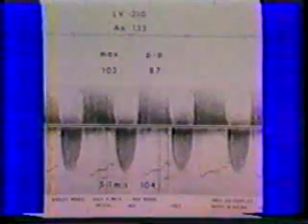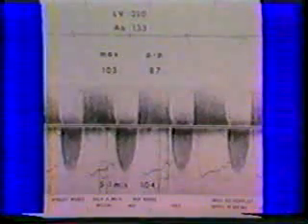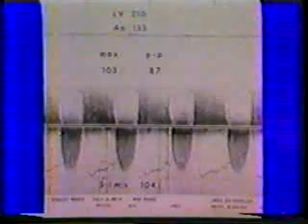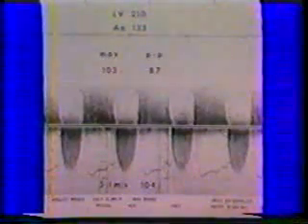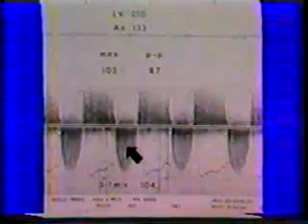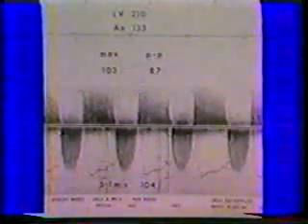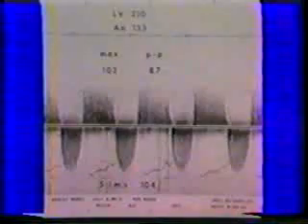When the Doppler examination for aortic stenosis is performed methodically, an excellent correlation is obtained with gradients measured in the catheterization laboratory. In a Mayo Clinic study, Dr. Philip Currie examined simultaneous Doppler and catheterization data obtained from 100 adult patients with aortic stenosis. This is one example from his study.